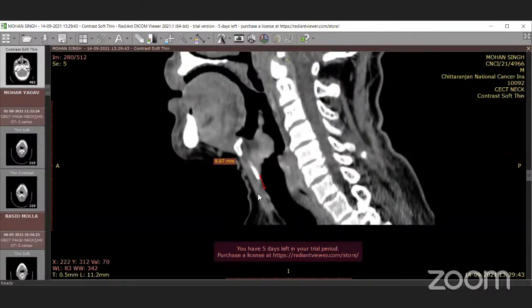Okay, so a surgical excision along this level is possible. However, the cricoid cartilage goes up to here, this level, and excision will be difficult in cases where there is minimal extension of the tumor along the posterior margin of the larynx into the subglottic segment.